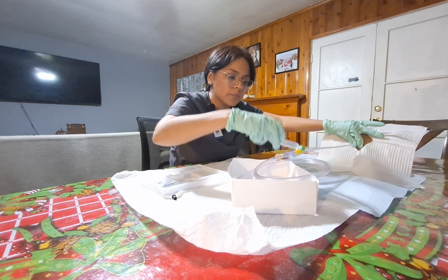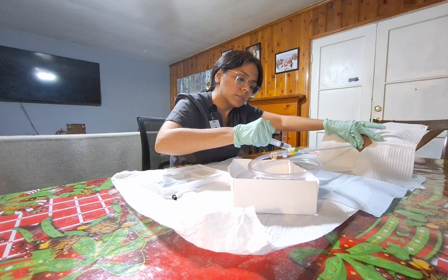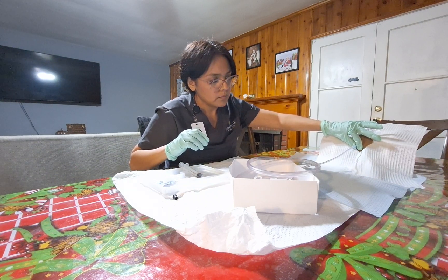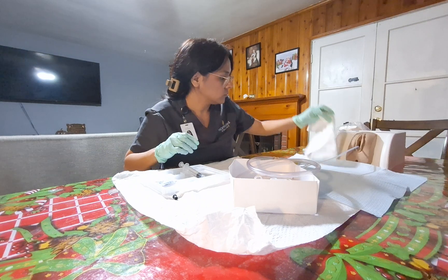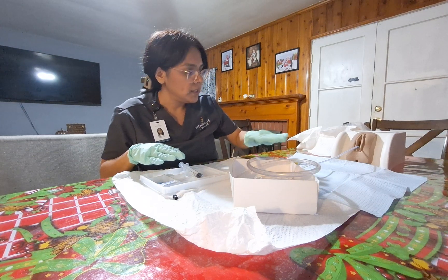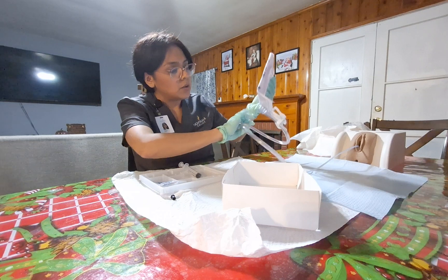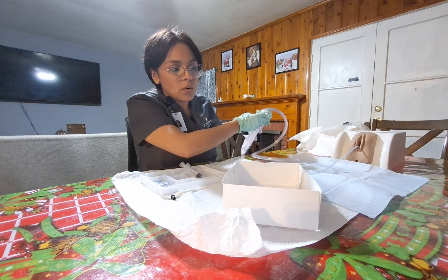I'm going to hold it with this hand and insert my 10 mls. I'm going to take the syringe off and pull back a little bit until I feel resistance. Now I'm going to remove the drape and dry the area. We're going to secure the tubing and tape it to the inner thigh, then place the drainage bag on the bed frame — not the railing — making sure it is at a lower level than the patient's bed.